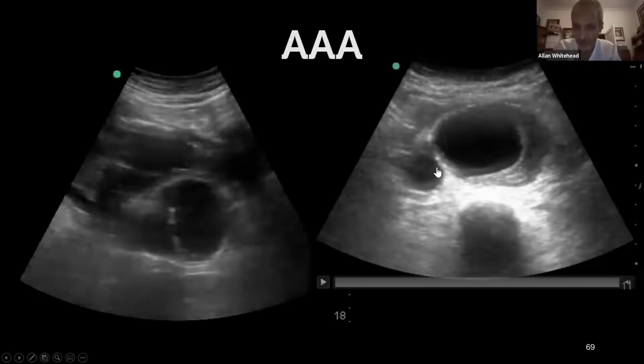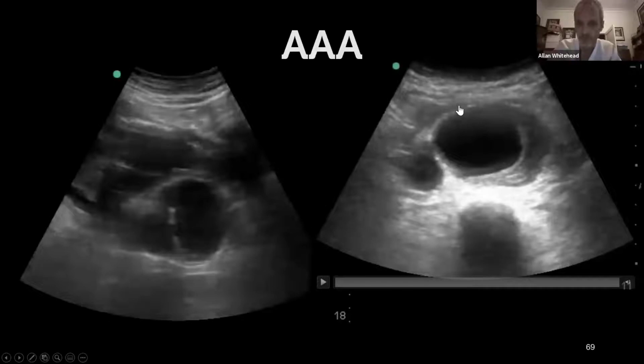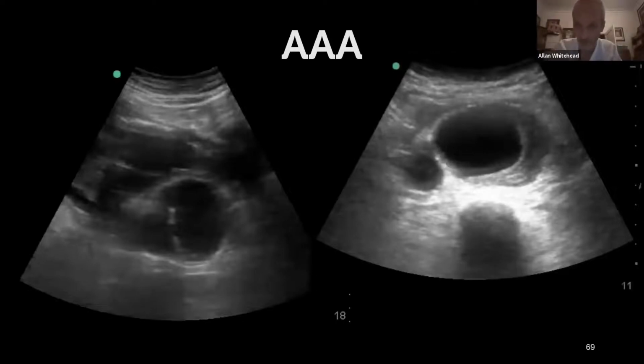That's outside the wall. No, I think that's outside the aorta, because you can track the wall of the aorta coming around here. There's no visible wall out beyond it, is there? So you would definitely say that, not that you can prove or disprove that they're leaking on an ultrasound, but on this case, with that image, you can prove that it's leaking.